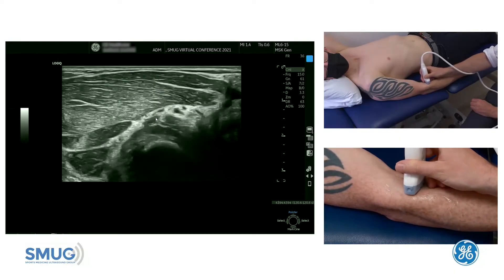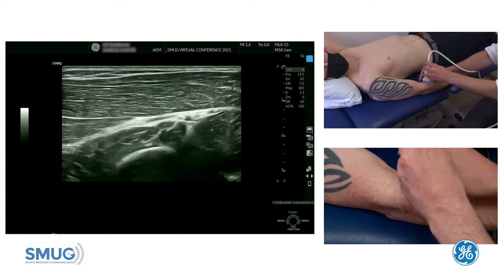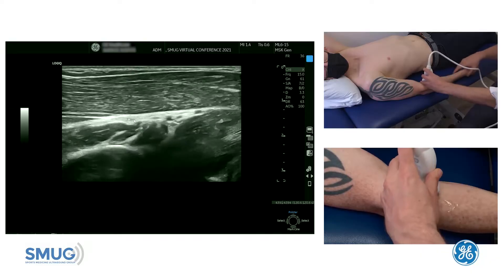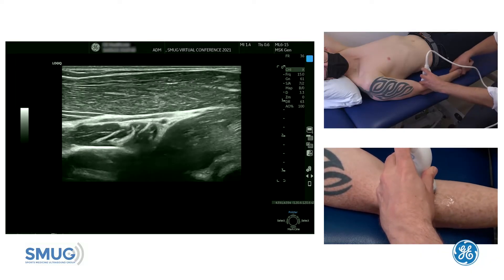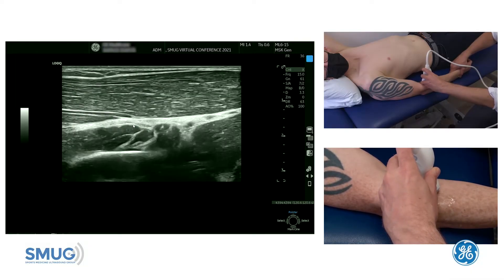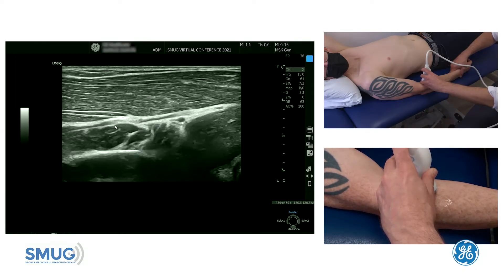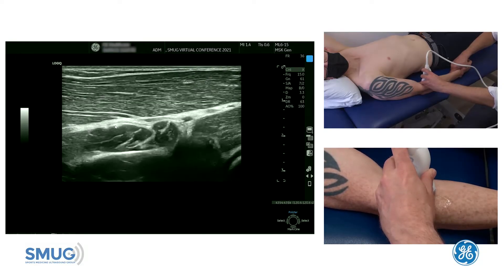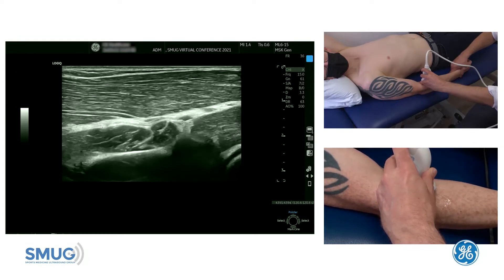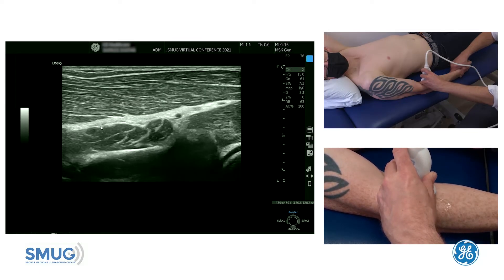Remember, it's not always at that point where you get the entrapment — these are pretty rare. We can also look at the nerve in longitudinal section. Follow it down to see where it splits, and just as it starts to go through the arcade of Frohse we can spin on that nerve to see it in long section and look for any kinking. We can use resisted supination — ask your patient to resist supination — and you can see a little bit of kinking on the nerve there. This nerve is slightly bigger as it goes through the arcade of Frohse.